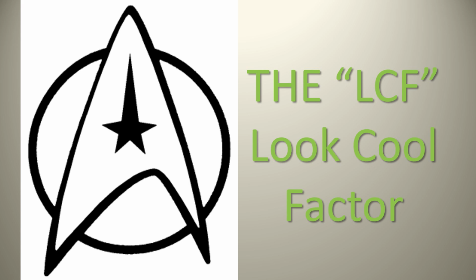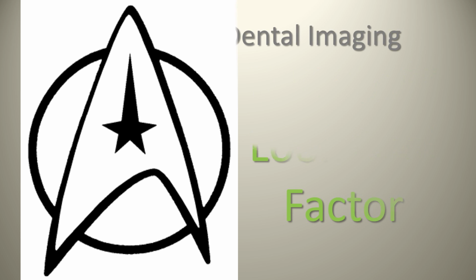So the question becomes, yes, it does look cool as compared to just a standard clinical examination of your patient or taking a proper history and physical. However, it doesn't necessarily add a lot to your, say, information base or database. But before we start talking about CTs, let's talk about the evolution of dental imaging.